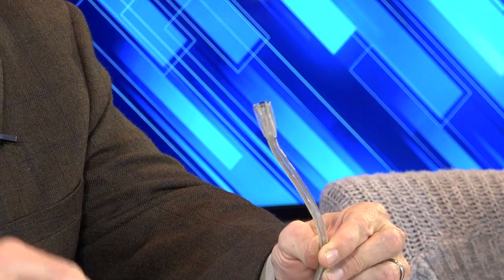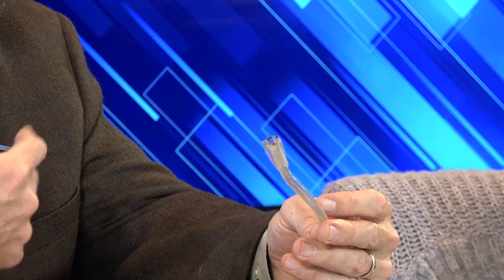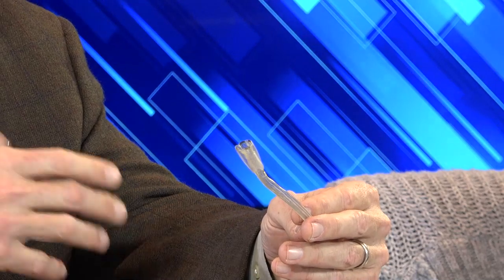So this is actually, I don't have my glasses, representative of the fourth generation of the cannula. There was a previous version prior to our company buying it, and that one was a 25 French outer diameter, with a different shaped balloon on the inside of the outer bag. It's worth mentioning because in some instances, we've gone to cases where the facility wasn't able to get a Gore DrySeal sheath, and because of that, they feel like they have to cancel the case. The answer is absolutely not. These cases were done 100% via cut-down when we first started, and they're still done via cut-down sometimes today.